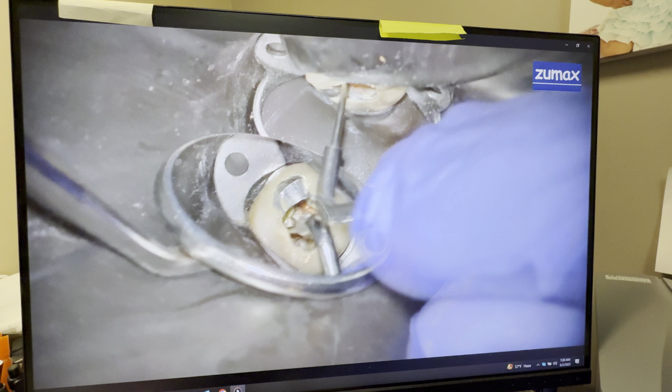All right, let's measure the mesiolingual now. I'm using the Fine Apex locator by 8 teeth. It has to be pretty much the same as the mesiobuccal measurement. You know, maybe 0.5 millimeter to 1 millimeter difference.